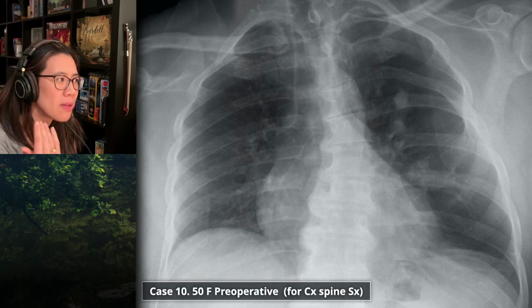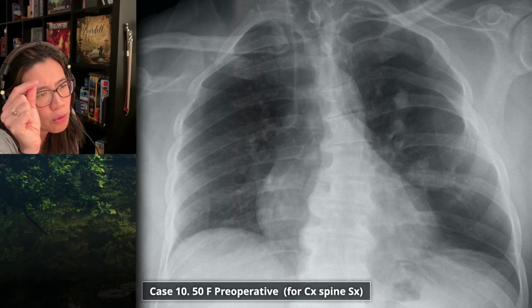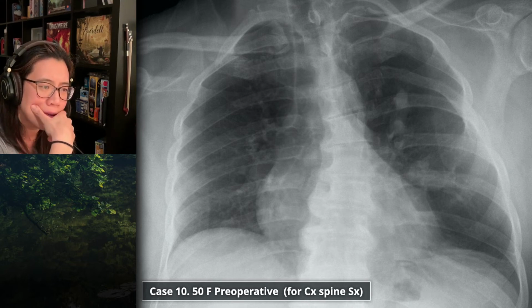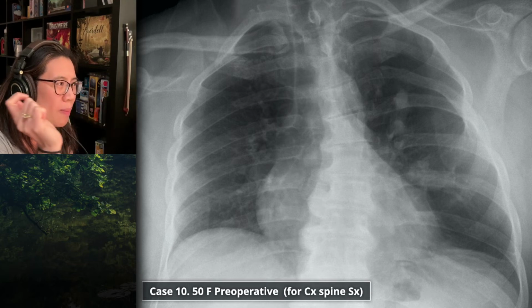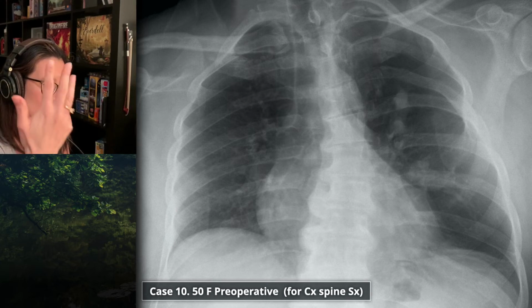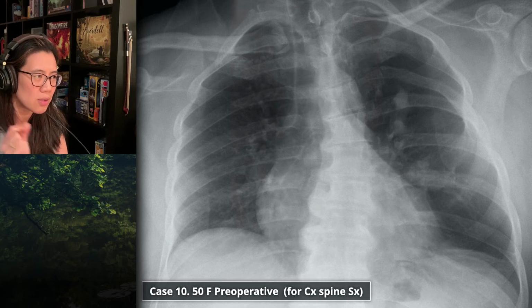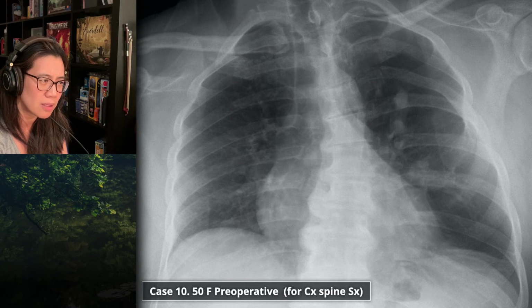And I don't see any markings about whether this is an erect or supine film. There's some deformity of her third and fourth lateral ribs. Ignore it. Okay, assume it's not there. Otherwise, there are some rounded densities in the right apical region, but I think they're probably by the by. The heart size is big, but I suspect this is probably an under-inspired AP film. She's got a scoliosis. So actually, I think scoliosis can probably cause apparent asymmetry of the projection of the lungs, depending on the severity of the scoliosis. I think it can have an impact on the way the lungs develop.